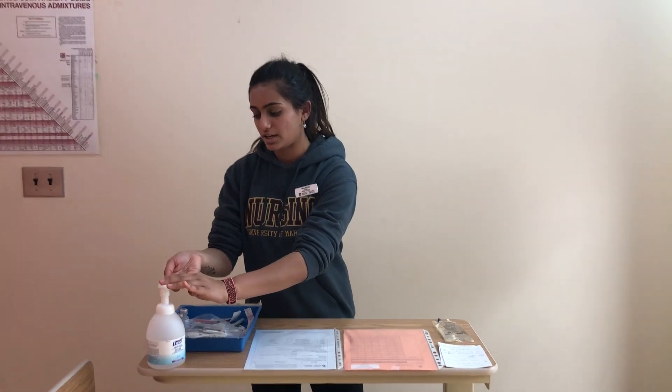Hi everyone, I'm Graciel and I'm going to be demonstrating how to administer methylprednisolone through mini bag infusion. So I'm just going to perform hand hygiene quickly.